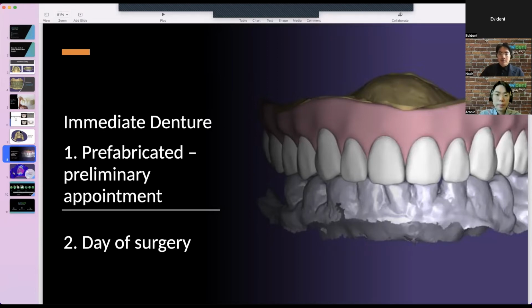Another thing is there are also a lot of alignment issues for edentulous cases. Arnold, do you want to tell everyone a little bit about your experience with alignment issues and what you can do for accurate alignment? Yeah, so after completing many cases with a lot of dentists, say for same day all on X, I realized that the major issue we face is the alignment issues, most of the time on the same day, right?